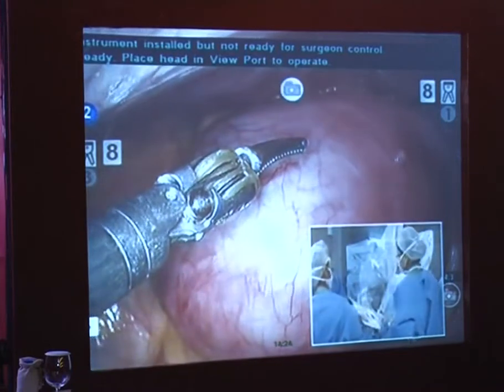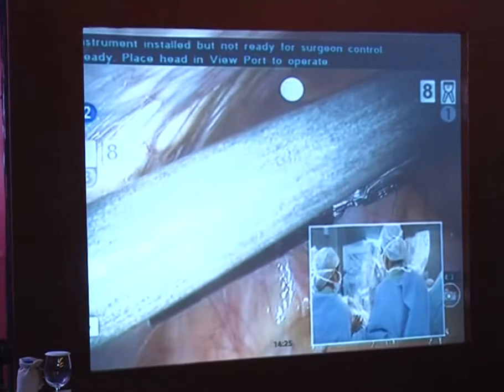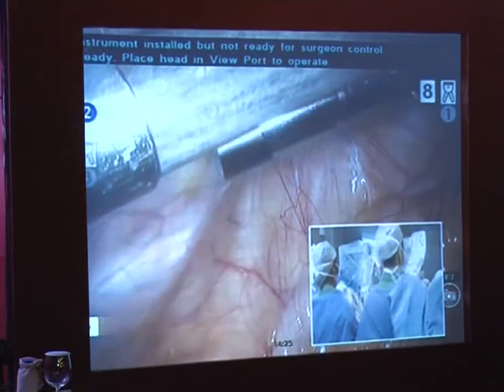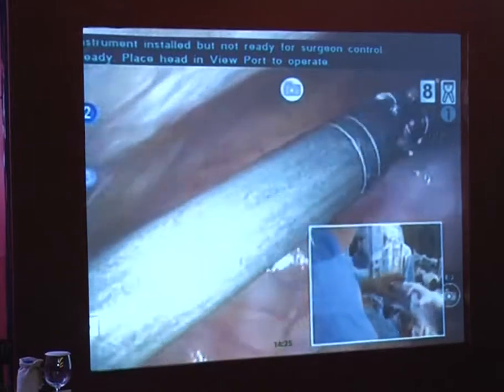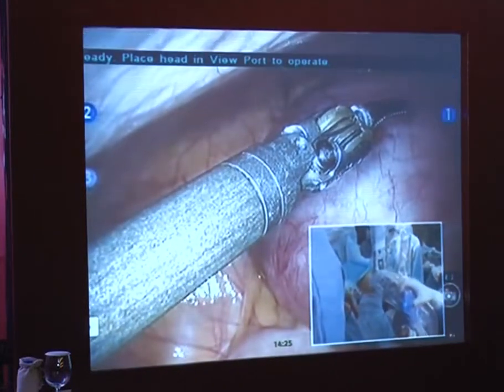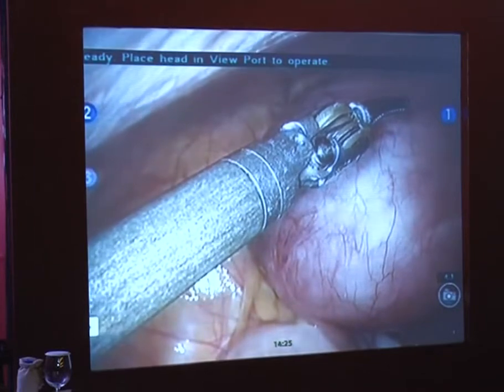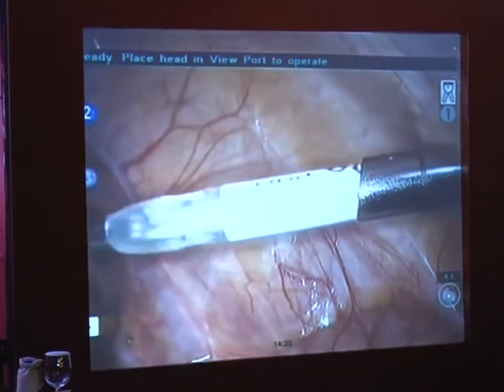Great. Okay, so what I normally do is have the bedside assistant inject with vasopressin. We don't need to have the uterus all the way in like this. We actually need it to be up, but just kind of held in the pelvis, more on the lower side, so that we don't have it so close to the camera. So this is going to be great, just like that. All right, I think we're pretty much good to go here. We'll introduce the vasopressin through the anterior abdominal wall with the spinal needle. I'll inject it, and then we'll be ready to rock and roll.